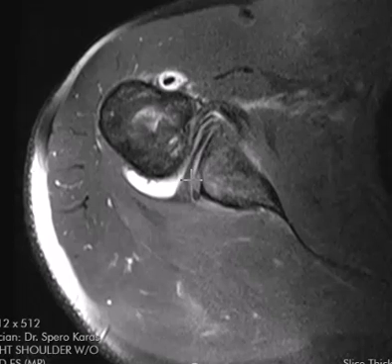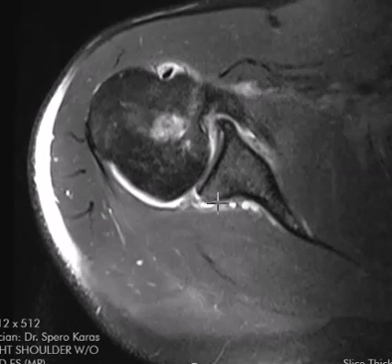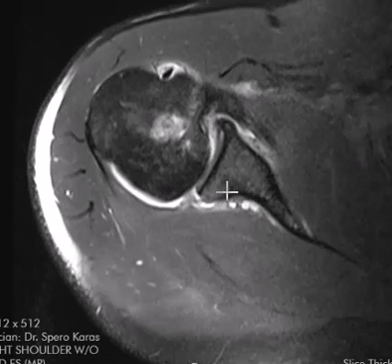Going down to the inferior labrum, we can see it all the way from front to back, and this is a reverse Bankart lesion.